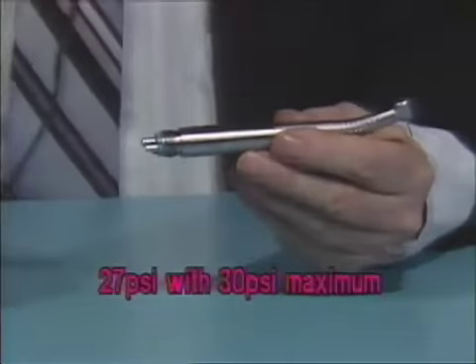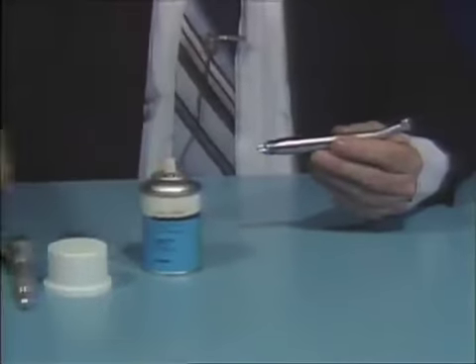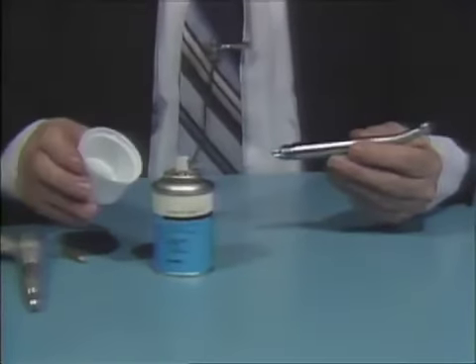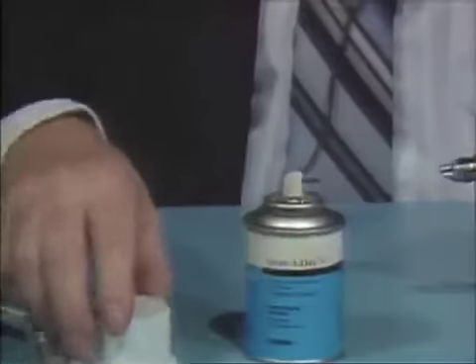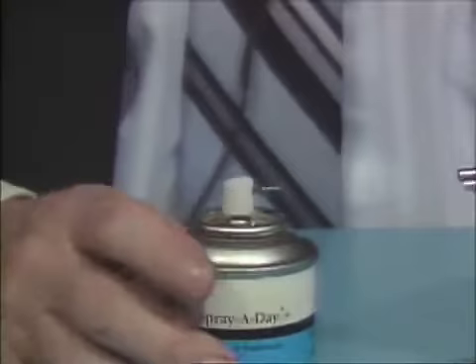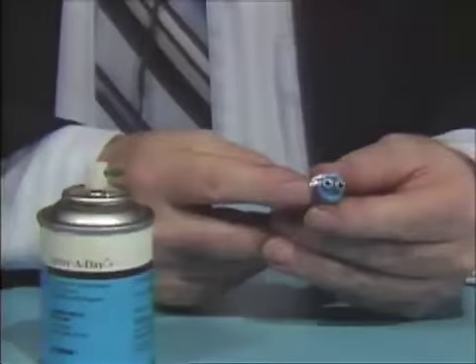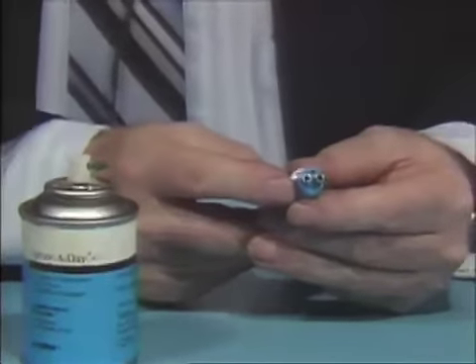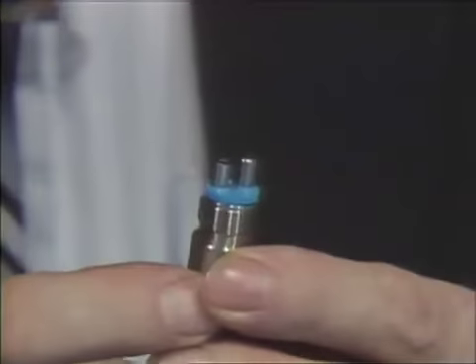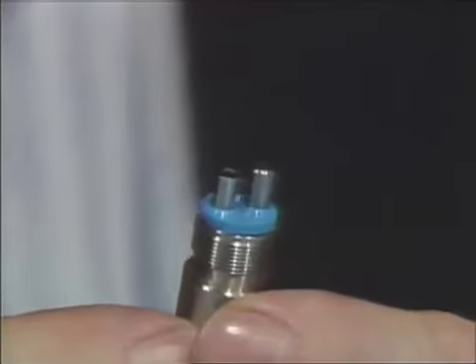The lubricant used for this handpiece is Spray-A-Day. The nozzle of the Spray-A-Day can is stored in the cap. Remove it and attach it to the can. The proper tube to insert the Spray-A-Day can is the shorter of the two large tubes — that is what we refer to as the drive-air tube.